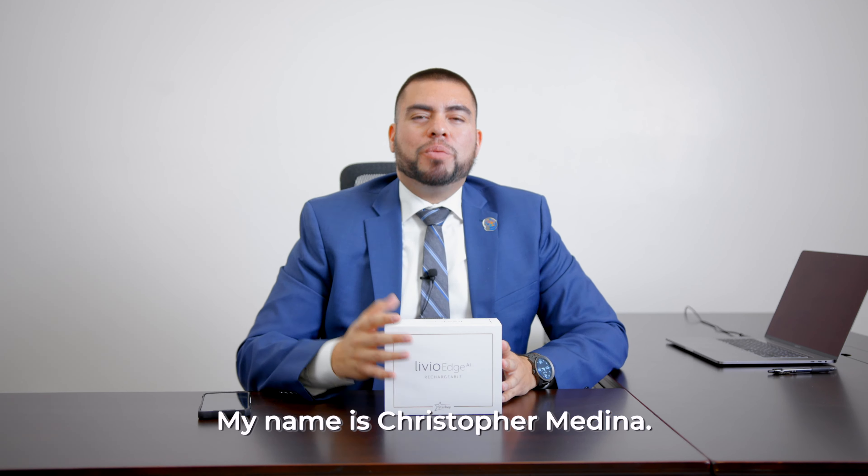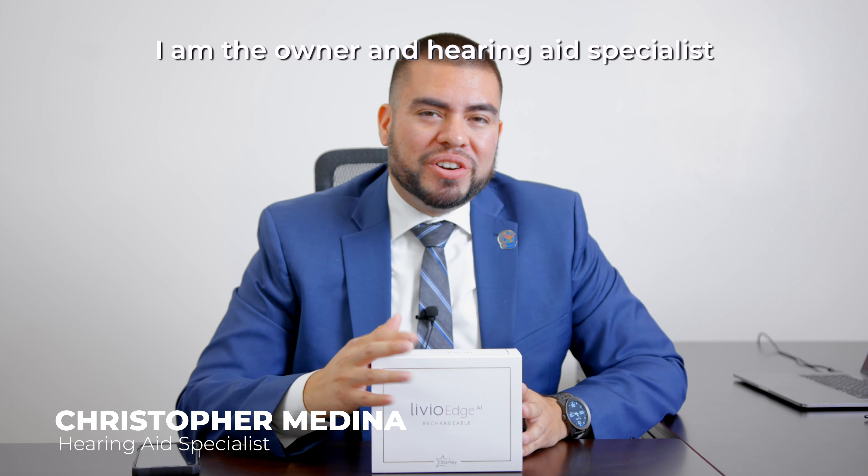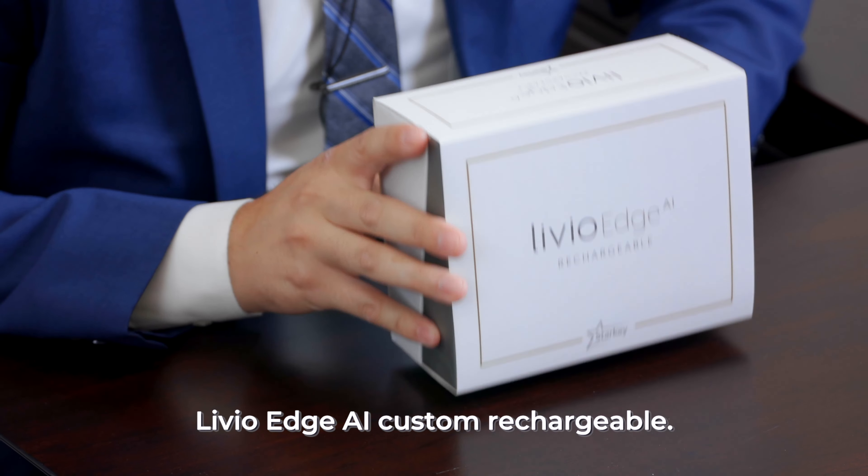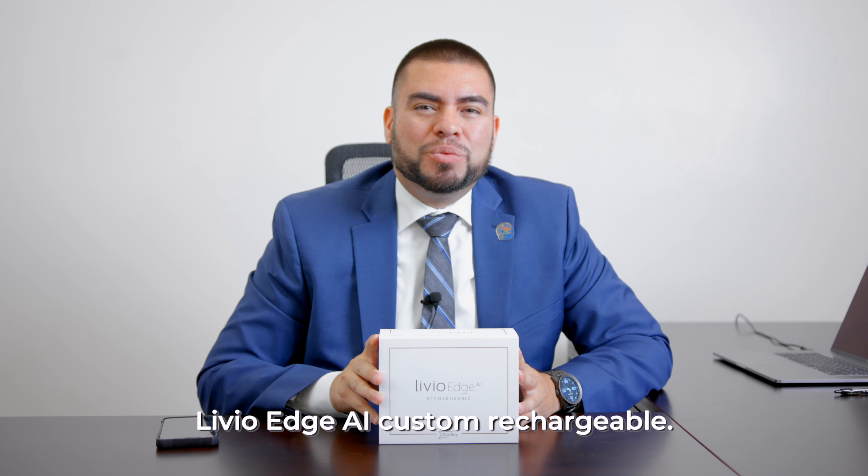Welcome everybody to another review video. My name is Christopher Medina. I am the owner and hearing aid specialist here at Virtua Hearing Aid Center, and today I'm going to be reviewing the Livio Edge AI Custom Rechargeable.